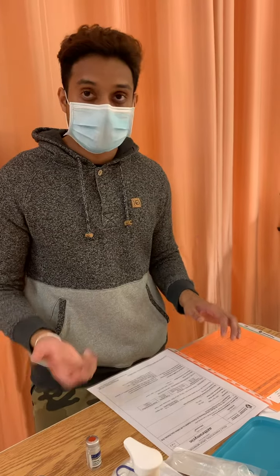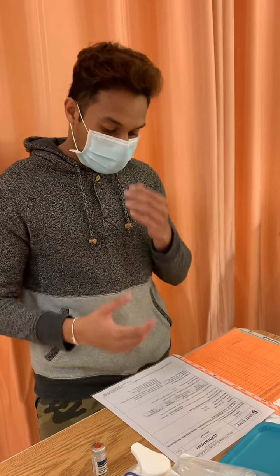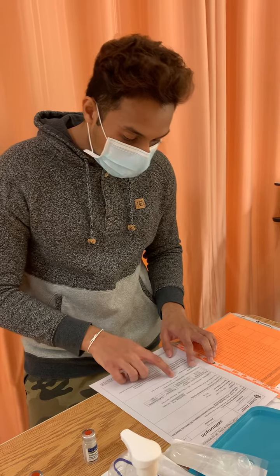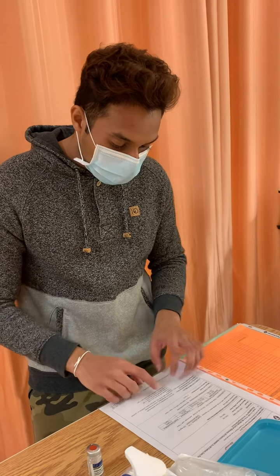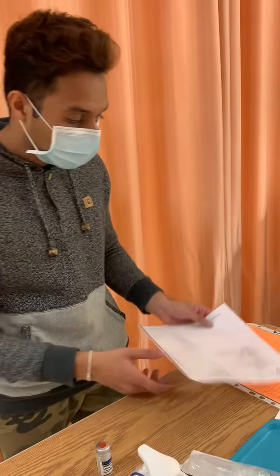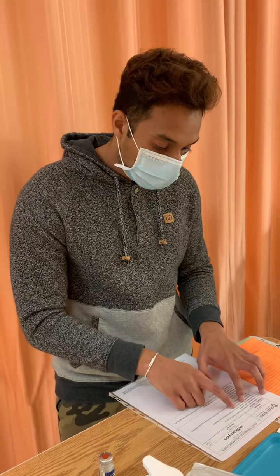We're administering over an hour because this is the first time the patient is taking the medication, so we don't want to administer too fast and cause irritation to the vein site. We want to make sure to monitor for adverse effects and make sure the medication is working. The maximum rate we see for a 500 milligram dose is 250 ml over an hour, so we're doing good there. The medication is compatible with normal saline, and the primary is running normal saline, so that's good. For potential hazards, we're going to assess for nausea, vomiting and diarrhea.